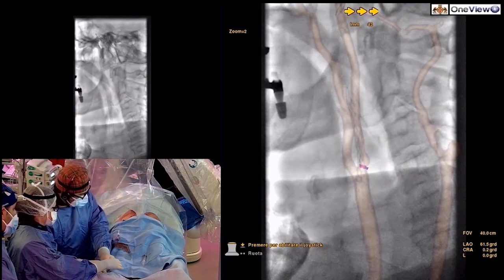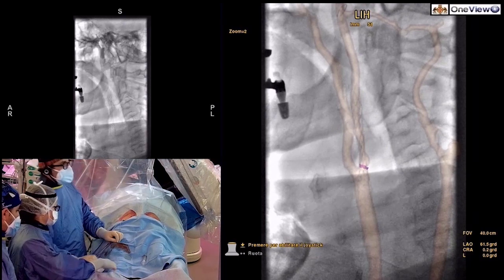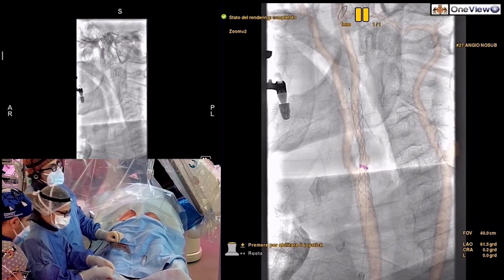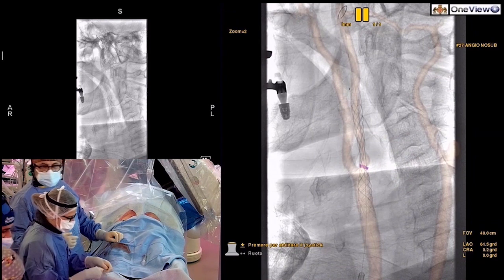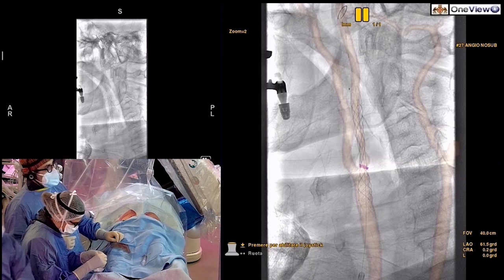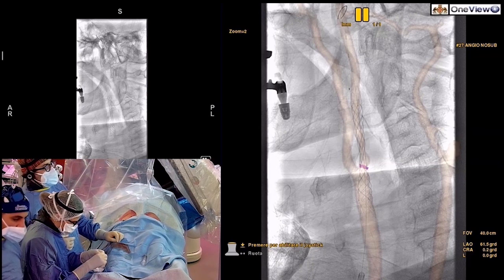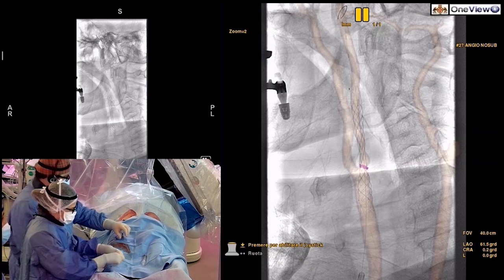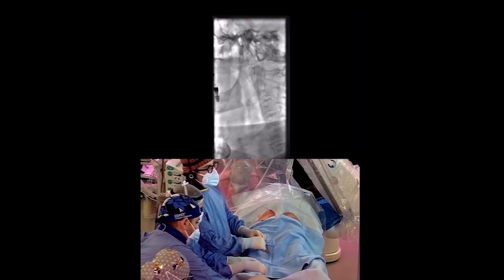Here we are. You can see very easily, with the high definition, all the markers of this specific stent, which has some additional markers both at the proximal and distal ending. You can also see the specific design of the mesh, in very high definition, to see the coverage of the plaque by the stent itself.